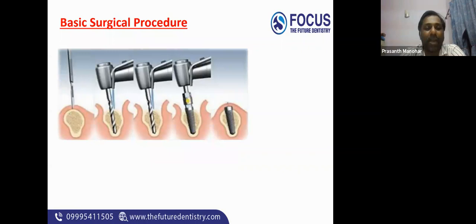Now basic implant procedure. Stage 1 procedure. In stage 1 you will have to raise the flap, expose the bone, and drill the bone sequentially so that we can get the sufficient width where we need to place the implant. After that, we will place the implant, then we will suture it.